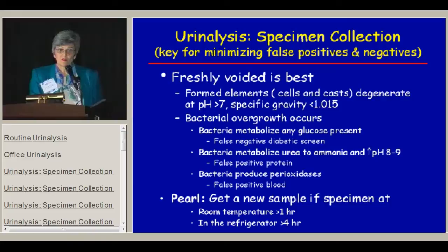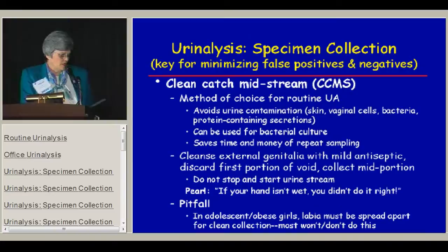Furthermore, if there's any bacterial contamination in the specimen, the bacteria tends to overgrow at room temperature. That can metabolize any glucose present to give a false negative diabetic screen. It can metabolize urea to ammonia, giving you a very high urine pH and a false positive protein screen. The bacteria can also produce peroxidases that interfere with the blood test, giving a false positive. The pearl here is: get a new sample if the specimen is at room temperature for longer than an hour or in the refrigerator for more than four hours.